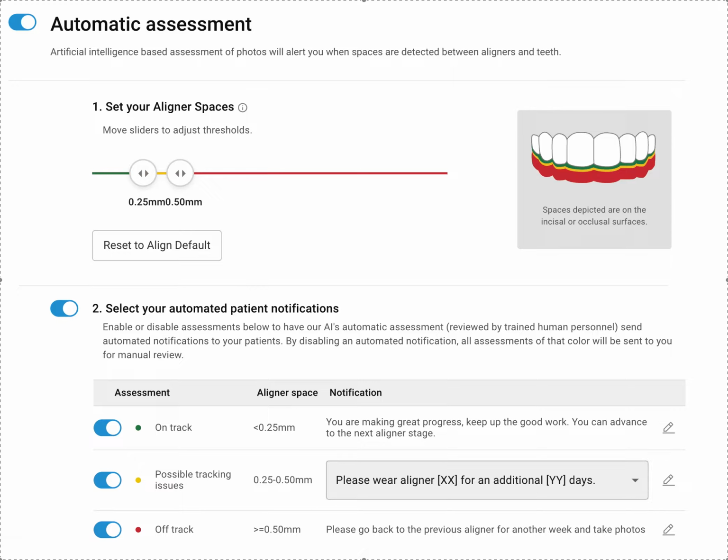If you can't figure out how to use an app and you need to come in and have your hand held, it's probably not me, because this is crazy easy. Obviously, if there's a problem that we're detecting on the app, there's a few different prompts that you can do, then you're going to come in, right? But it keeps the patient in an accountability loop, a virtual accountability loop. They're checking in every week.